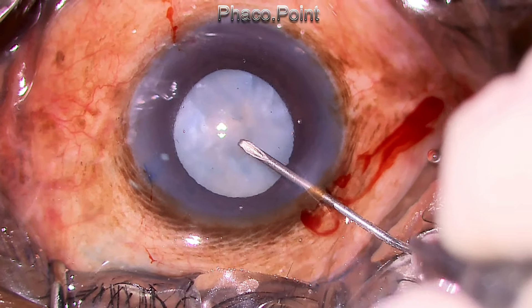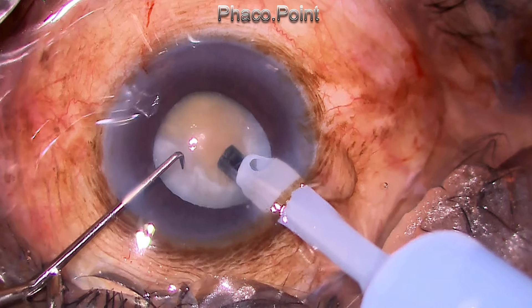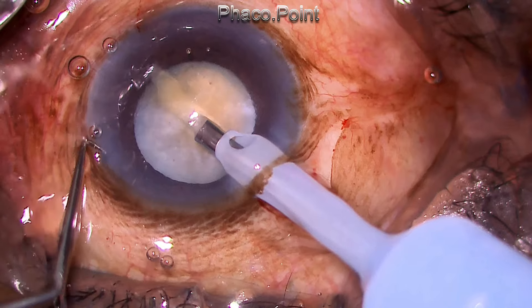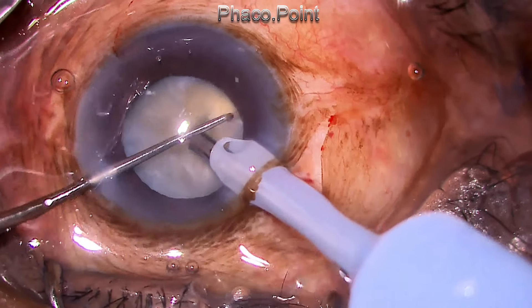After the capsulorhexis is successfully completed and the superficial cortex is washed off, the phaco procedure is launched using a power of just 40 percent. As the phaco chop begins, conjunctival ballooning was starting, so this was attended to immediately — nipping it off at the bud — because conjunctival ballooning in later stages produces a lot of problems with visibility and performing the procedure. Now back to the direct phaco chop.